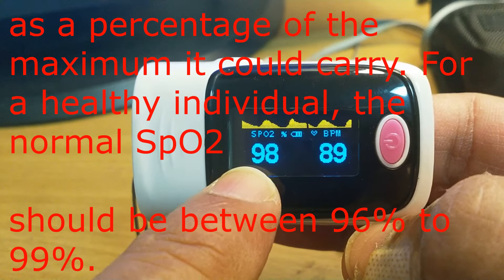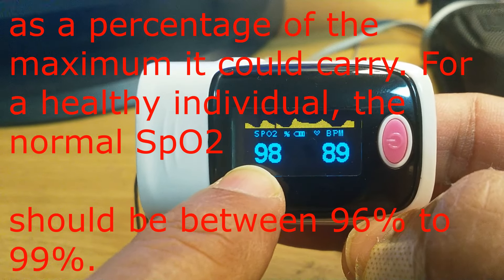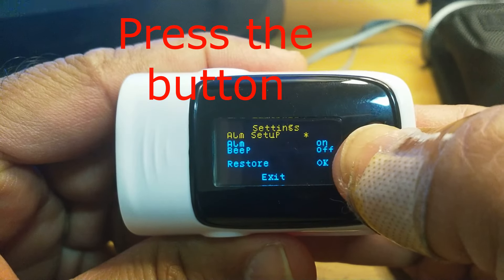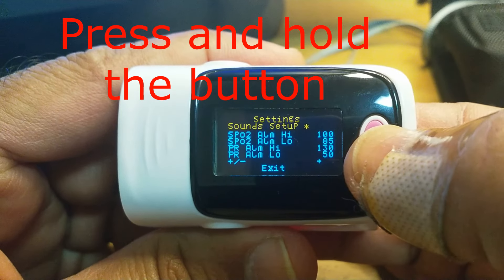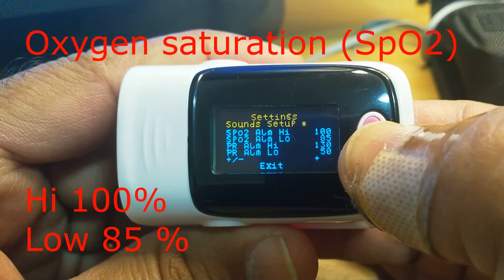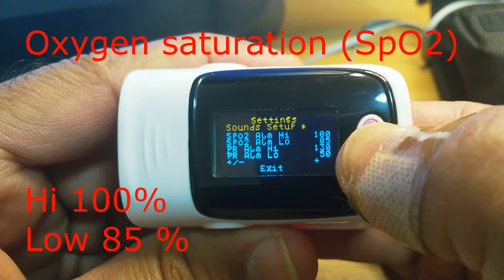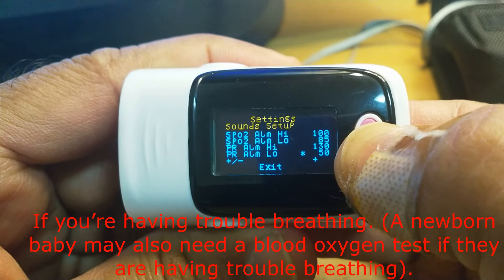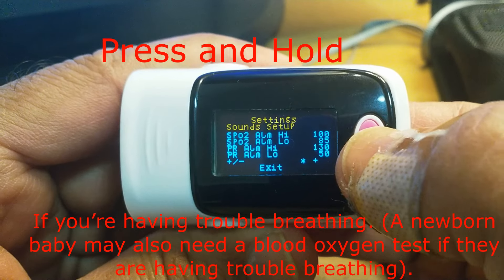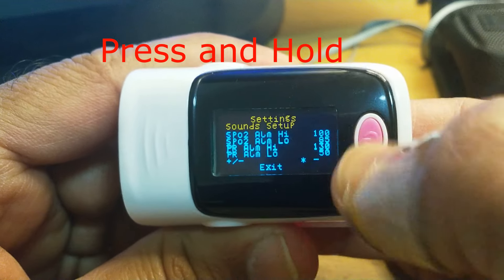I will change this setting to 97 or 98, then it will give you a beep. Press one time, again, again — continuous press. Now you can see: SpO2 alarm high is 100 and low is 85, pulse alarm high is 130 and low is 50. Here there is a plus sign.